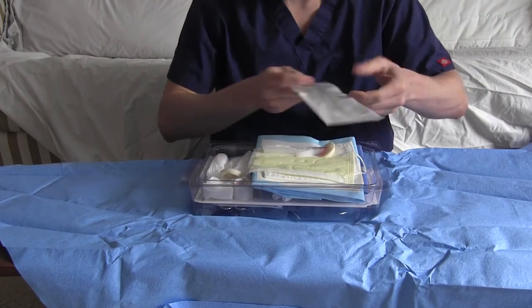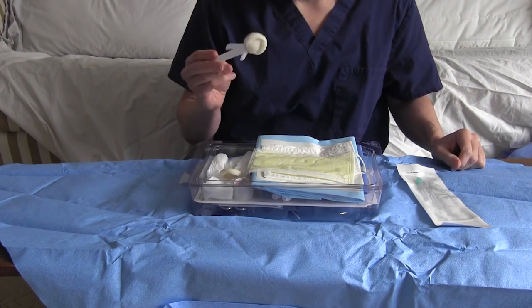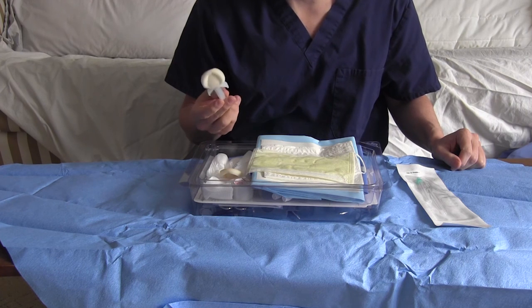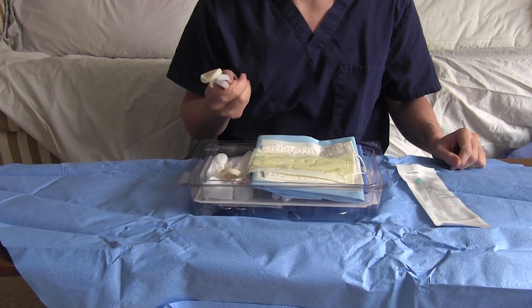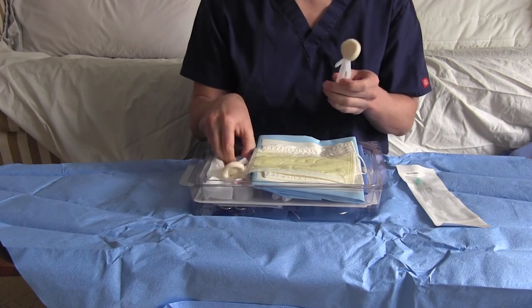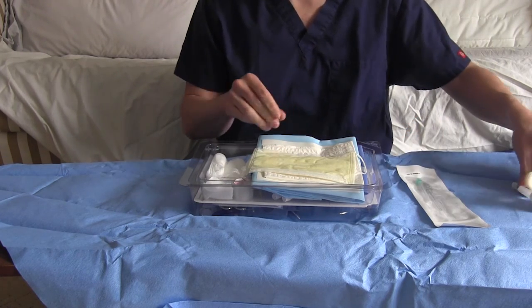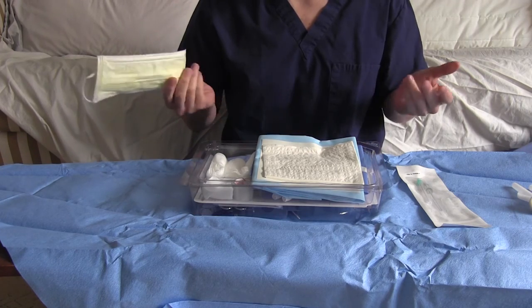You have your set of needles. We're going to put this aside for now. We're going to use that later. You have your ChloraPrep stick, and I would have already prepped the patient prior to this point. I don't like prepping when already fully sterile. I have a tendency to lose sterility at that point, but they're there for you. There's 2 of them. Yet another mask, I guess, if you have another observer who shows up, I don't know.